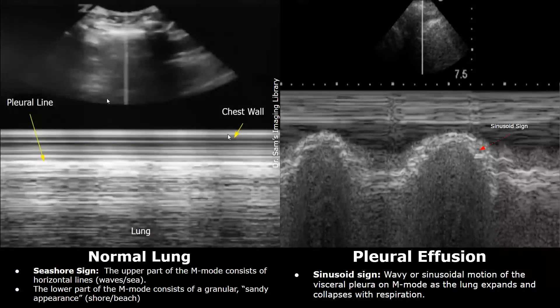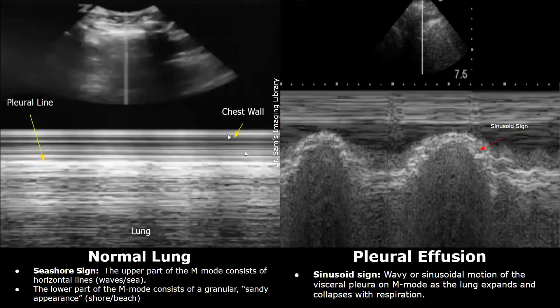These are images showing the M-mode appearances. On the left we have the M-mode of a normal lung. The normal lung's M-mode gives a seashore sign. The upper half consists of straight horizontal lines which constitute waves — the sea. This hyperechoic bright line is the pleural line. The lower grainy part of the M-mode is the lung, with a granular sandy appearance resembling the shore or beach. The upper half looks like waves and the lower half looks like sand.